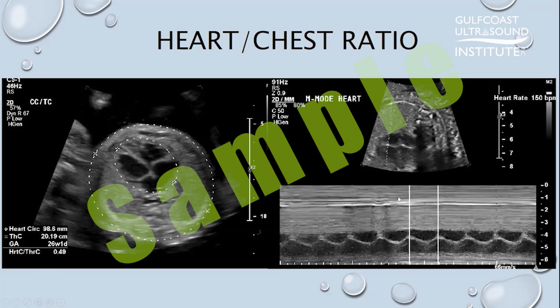And then usually following the LARA principle, we will document the heart rate with M mode. And then we'll also be doing the inflows and outflows with Doppler.